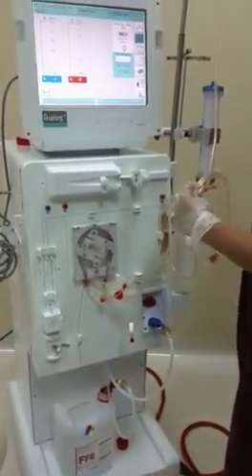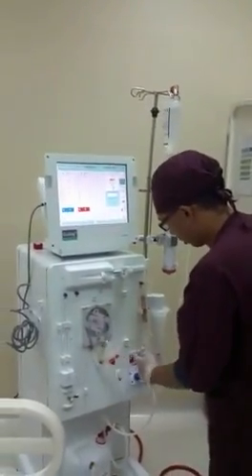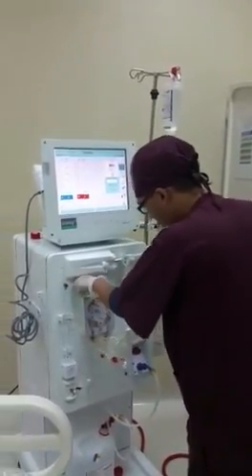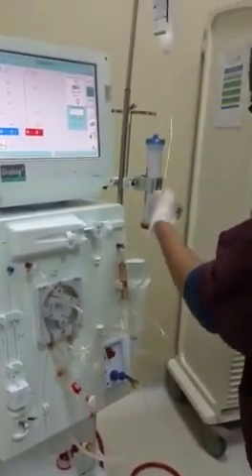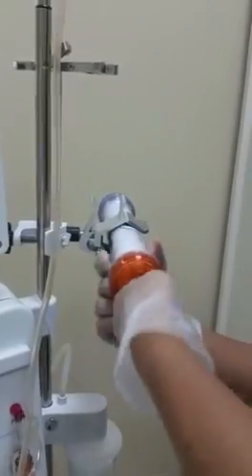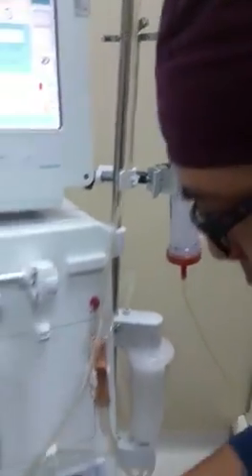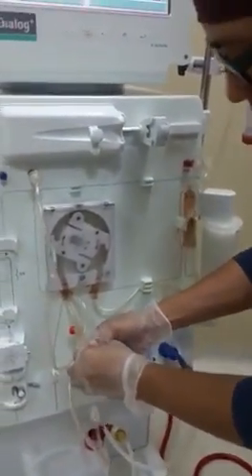We will start from the rotor. Then we can clamp everything that is not in use.